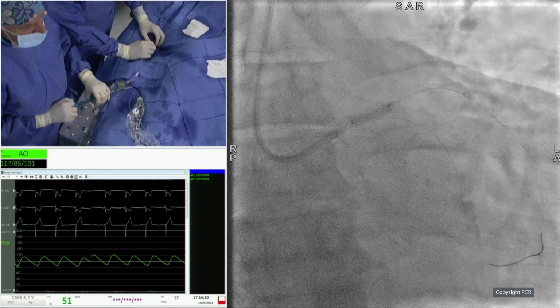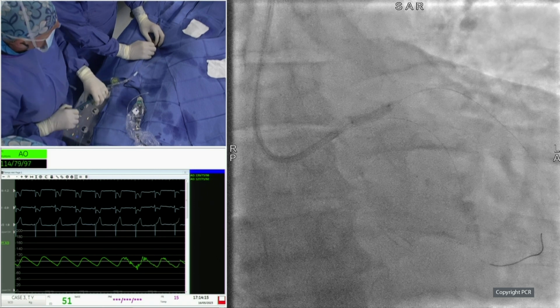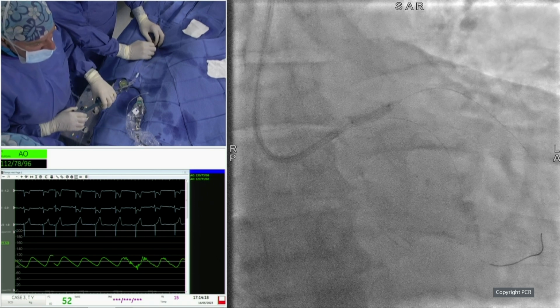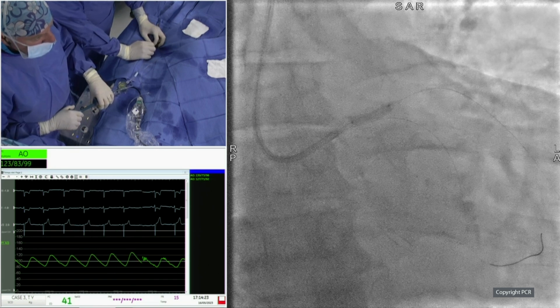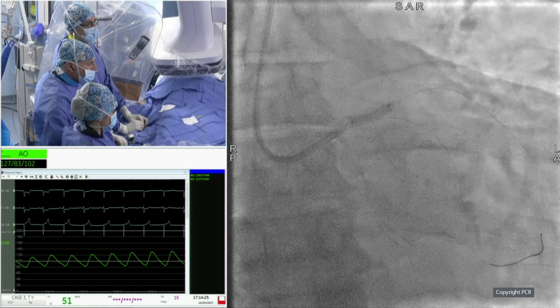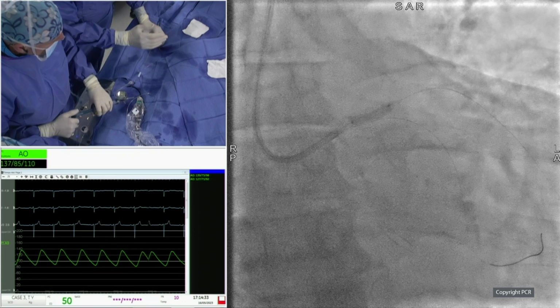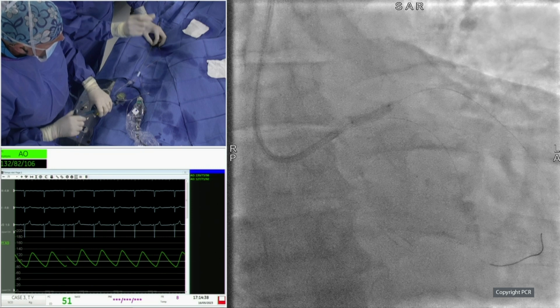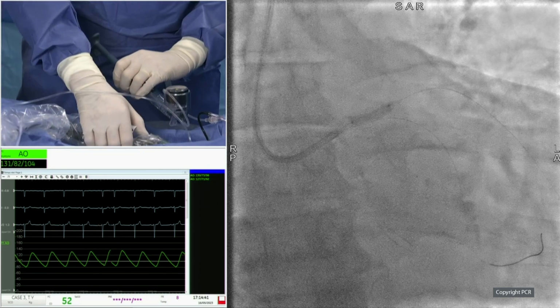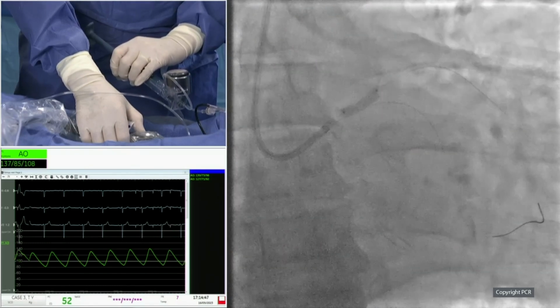But for the moment, the hemodynamic tolerance is good. We see on the ECG some modification, so probably we will leave a little bit the patient to recover. It's important to notice that. Okay. We have already done 4, maybe 4 is okay. We will wait a little bit. Bruno, what is really important with the shockwave balloon is not to deflate during the delivery of energy and wait a couple of seconds before deflating the balloon after stopping delivering energy.